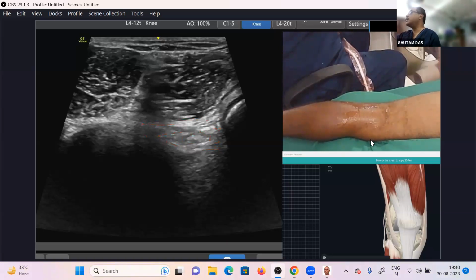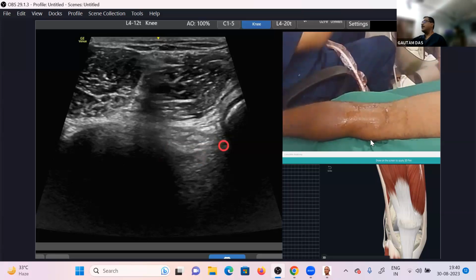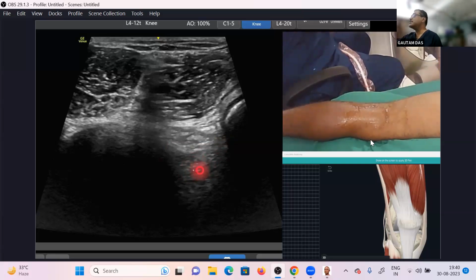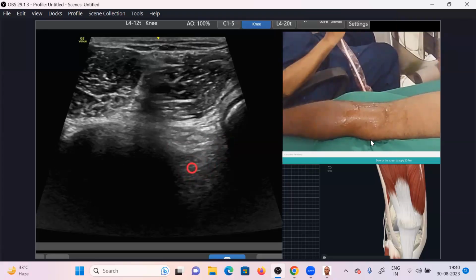I'm reviewing the drawing, and again try to understand. Can everybody understand? So, a nice picture now. Again, three longitudinal layers you can see. One is your oblique popliteal ligament. Then the second layer is a cross section of the posterior cruciate ligament, and this is your little bit of sagging anterior part. And here is your ACL, again a cross section. Everybody can appreciate or not? Yes, sir.